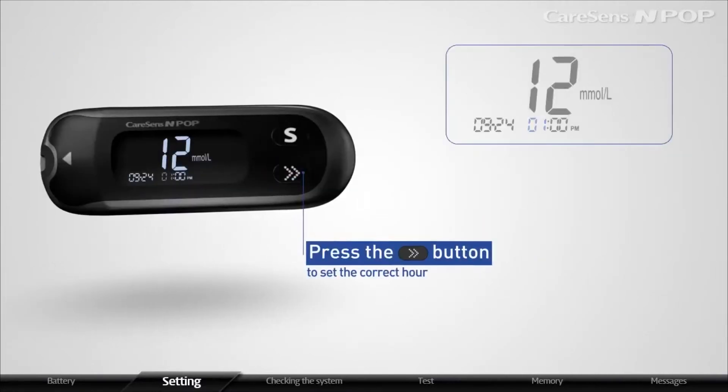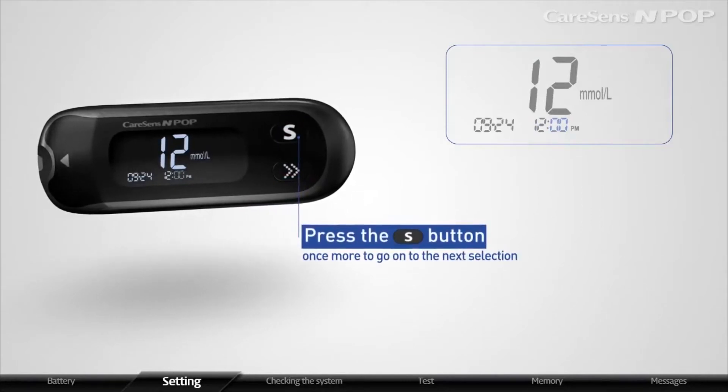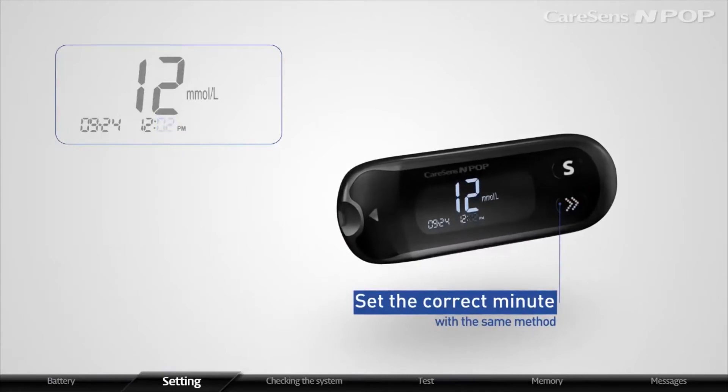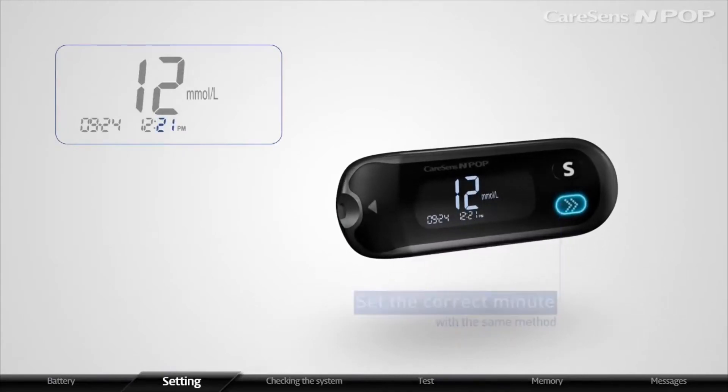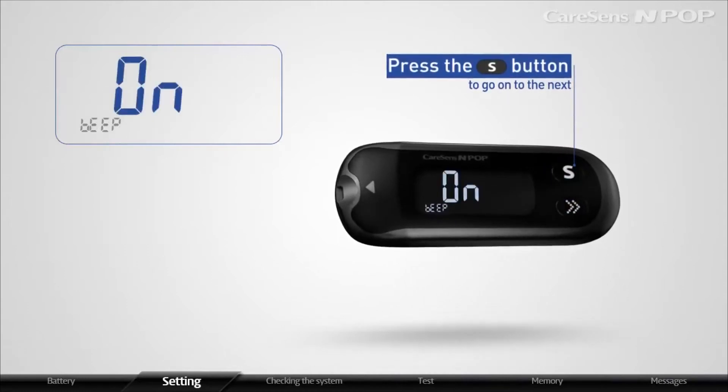Press the arrow button to set the correct hour, then press the S button once more to go on to the next selection. When the minute blinks on the display, set the correct minute with the same method. After setting the correct time, press the S button to go on to the next.